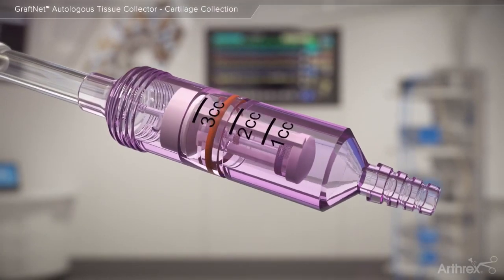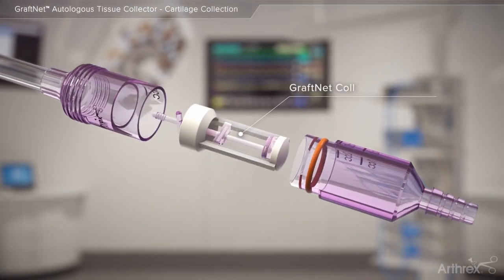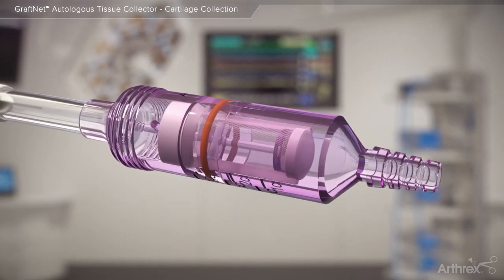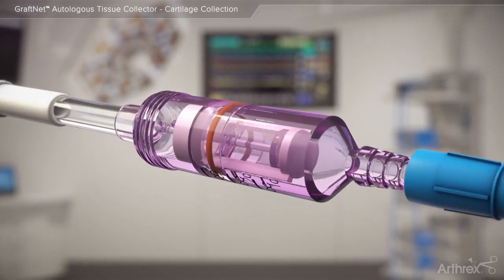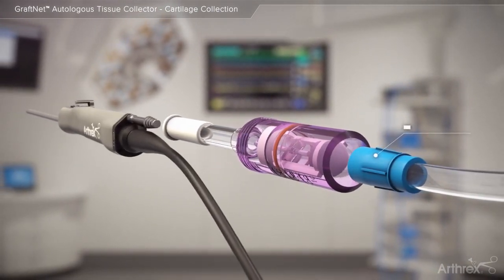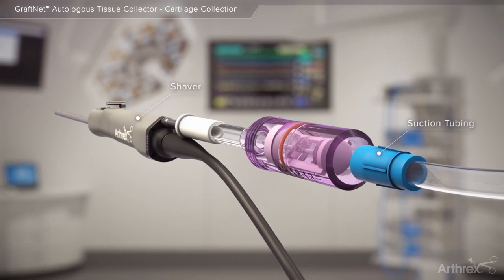The suction activated GrafNet device is designed to collect autologous tissue for a multitude of applications. When connected in line to suction and an arthroscopic shaver, the GrafNet may be used to collect particulated autologous tissue into a sterile, filtered chamber.